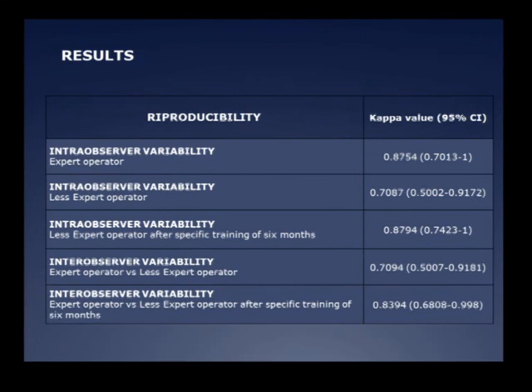It is a part of the big world of transvaginal ultrasonography in deep endometriosis. But it's interesting in this moment, because some coronal planes are very important to obtain. It's an unusual plane. The coronal plane is surely a good plane to obtain information, for example, for uterosacral ligaments. It decreases the number of false negatives.